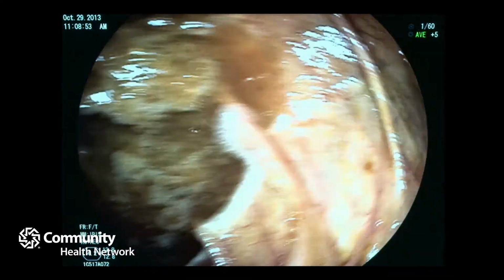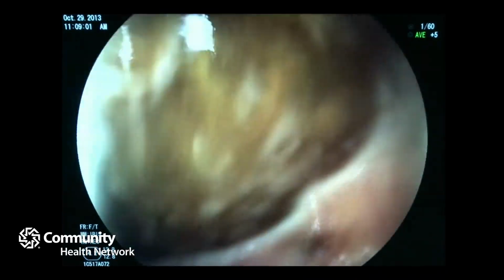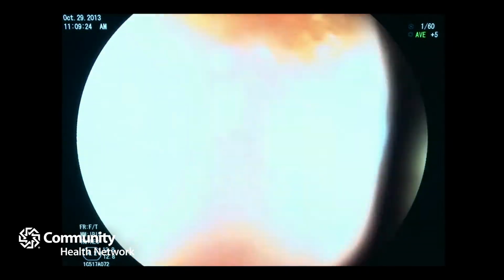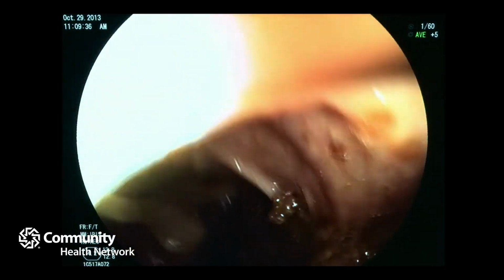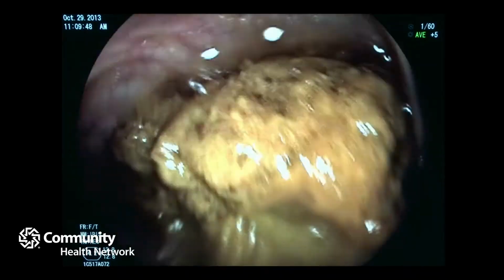So we're actually at the end. This here is her cecum. And how do you know that? Normally I would give you some anatomic landmarks. Let's see if I can flip in to show you. One of the identifiers is that you always have to have what's called a cecal intubation, where you're looking for this crow's feet or a Mercedes sign, the appendix, or I'm going to see if I can flip into her small intestine, her ileum. So that's her ileum. Ah, I missed it. I just missed it.